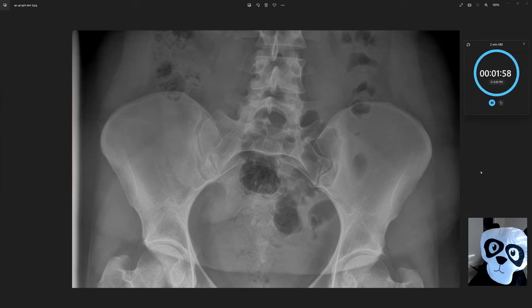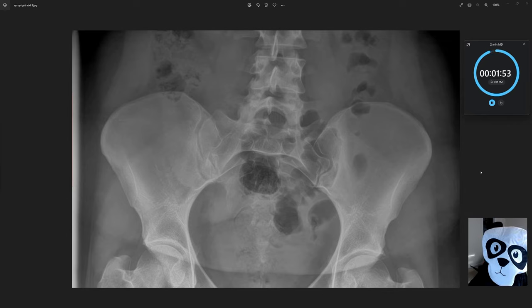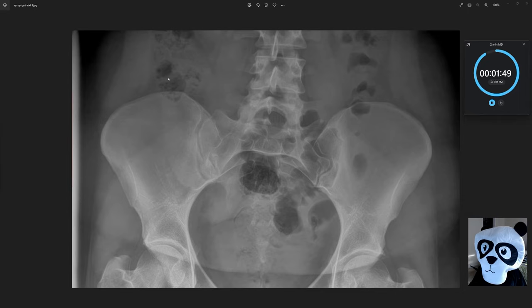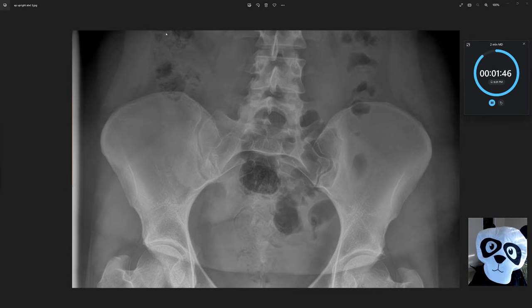Here we have an AP upright view of the lower abdomen. Looking at our bowel gas, we can see the cecum over here in the right lower quadrant as it continues as the ascending colon.